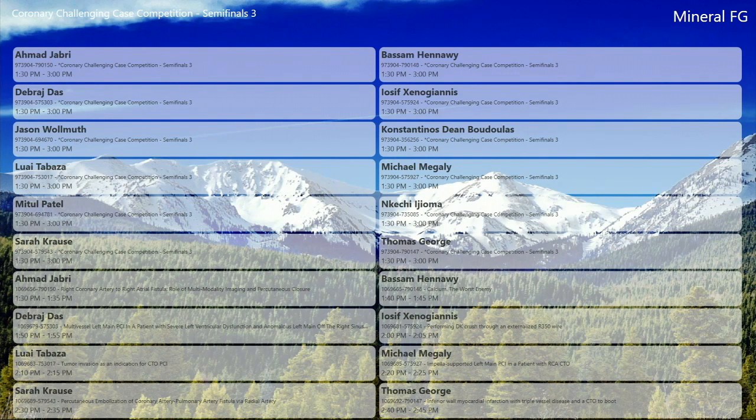Yeah, and it has become our routine for our hybrid procedures too. We do the PCI of the culprit on day 1, day 2 they get their bypass, and they're already loaded on Plavix. I did a case just 2 days ago with a colleague of mine, and he had limited conduit, so we were going to stent his circ, and then he was going to get an off-pump LIMA, and be sent for potential RCA CTO PCI if he had residual angina. We ended up working on his circ, dissected it, and ended up having to put quite a bit more stents.